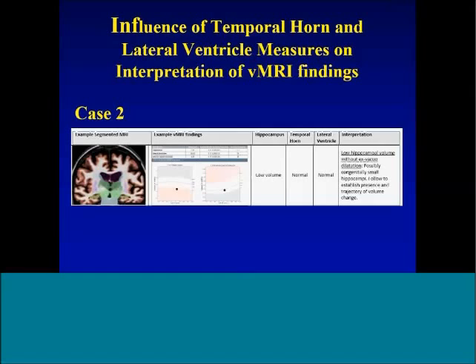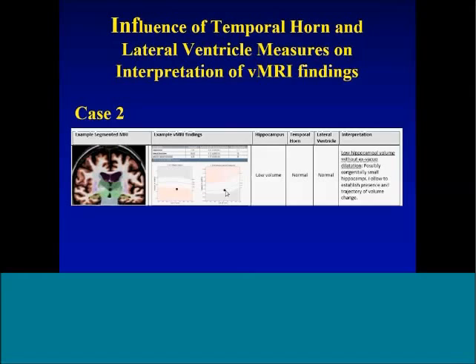Here's another example: this person's brain scan shows no ex-vacuo dilatation of the temporal horn, yet the hippocampus is out of the range of normal — at the fifth percentile or less. With no additional support for ex-vacuo dilatation, it may be that this patient's hippocampus was always this small — it might have always had a low volume and we lack the ancillary measure confirming it used to be bigger. You may want to follow that patient to see whether the trajectory of volume loss supports neurodegeneration or just a congenitally small hippocampus.